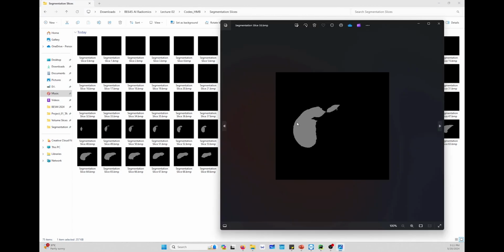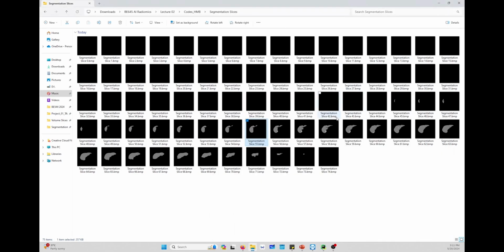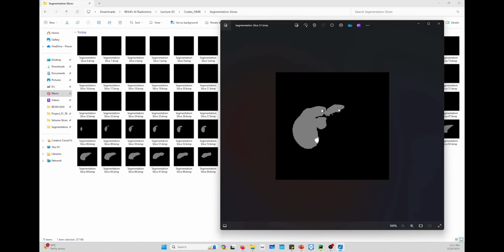So as you see here, the liver has a grayscale value of 127. What about 255? As you see in that image, there is a liver with 127 grayscale value, and you see here 2 regions in white that reflect the values 255, and simply this can be described during the data acquisition. You can retrieve data that says we are segmenting the liver, and then we are segmenting the tumor in that liver. So the white regions here reflect the tumor.